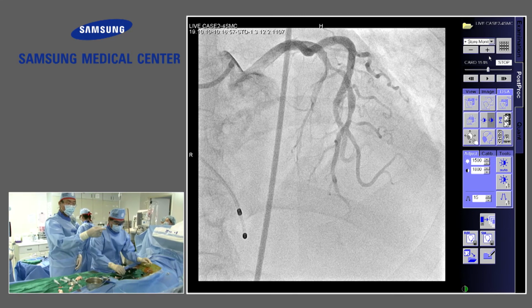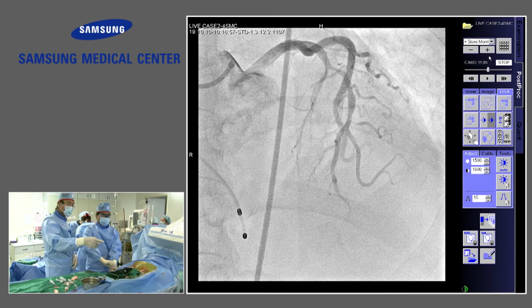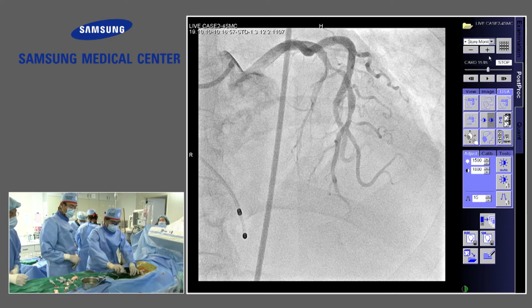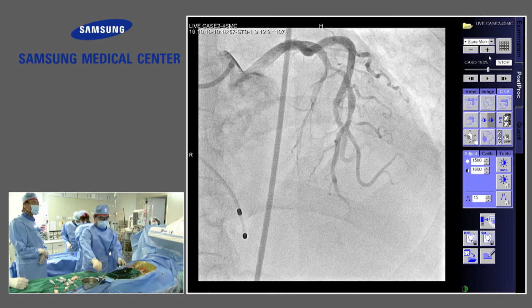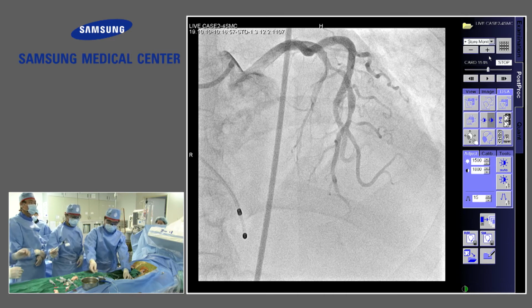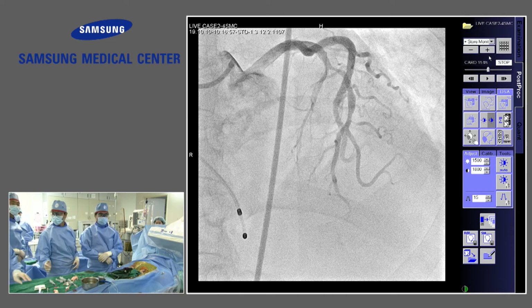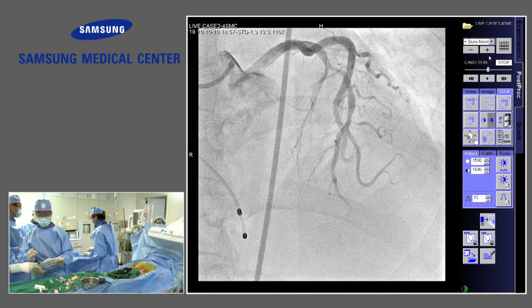It looks like a pretty straightforward procedure with the coronaries. And again, if the patient is not having renal problems, renal failure, he could put here even a direct 3.0 over 20 millimeter stent and finish it in the same session. In this case, actually, I agree, the creatinine is normal.